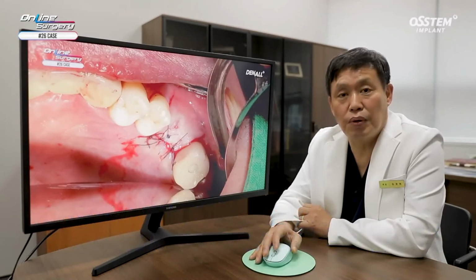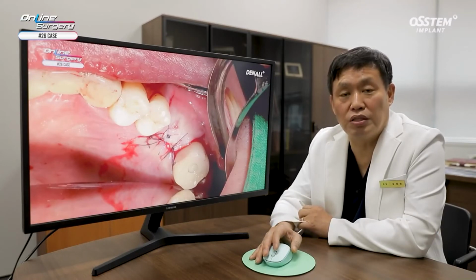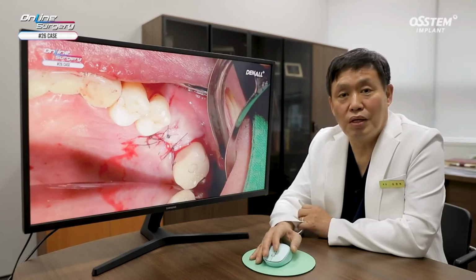After implant placement, between the buccal plate and the implant, there was a gap. I used allogenic bone for bone graft, utilized a collagen membrane, and did suture and completed the surgery.